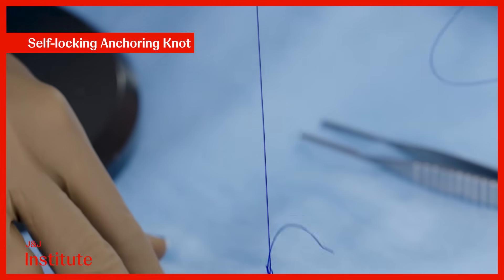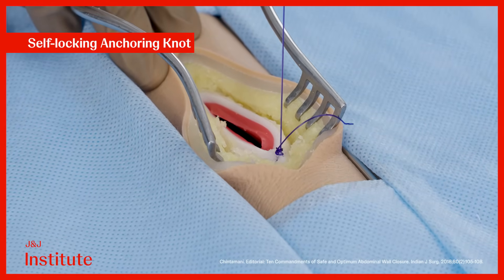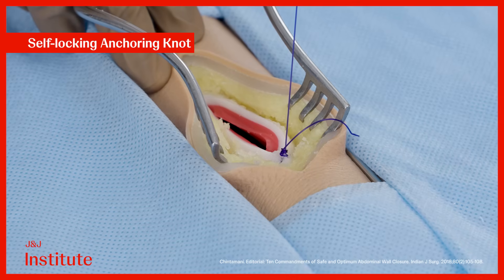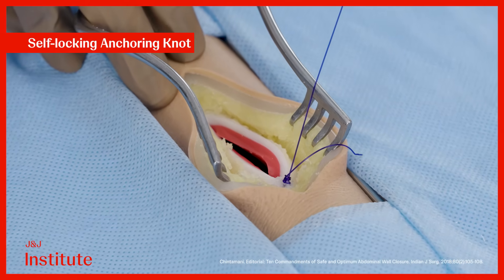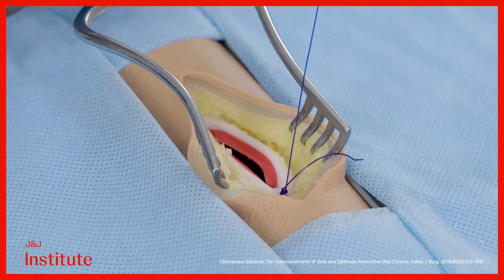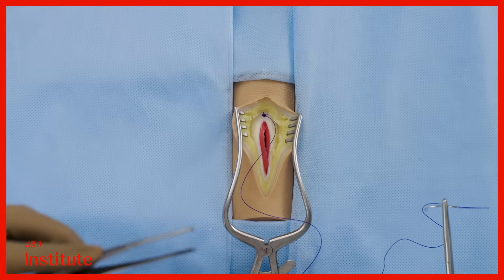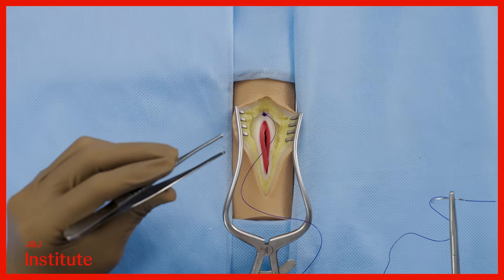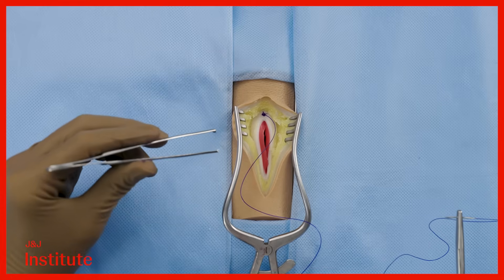This self-locking knot tightens on applying tension to it, losing only about 5 to 10% of its tensile strength, unlike the classic surgeon's knot which loses about 40%. Cut the short end of the suture at a distance of about 5 mm. A continuous closure is preferred as it reduces the number of knots and consequently the potential points of weakness within the closure.